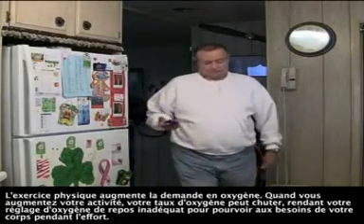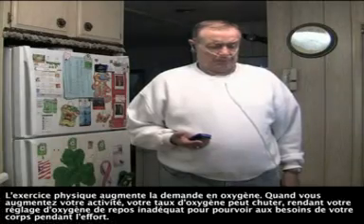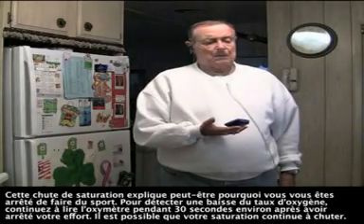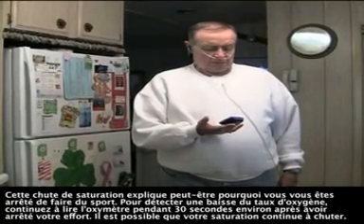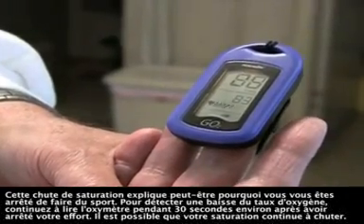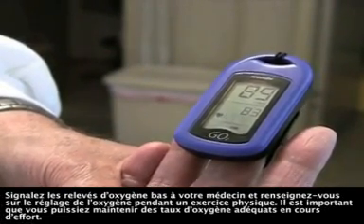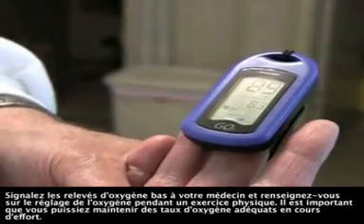When you increase your activity, your oxygen level may drop. Therefore, your resting oxygen setting may be inadequate to meet your body's needs during exercise. That saturation drop may be the reason you had to stop exercising. In order to detect the lower oxygen level, keep reading the oximeter for about 30 seconds after you stop exercising. Your saturation may continue to drop. Report low oxygen readings to your doctor and get instructions on adjusting your oxygen setting during exercise. It is important that you are able to maintain adequate oxygen levels during exercise.